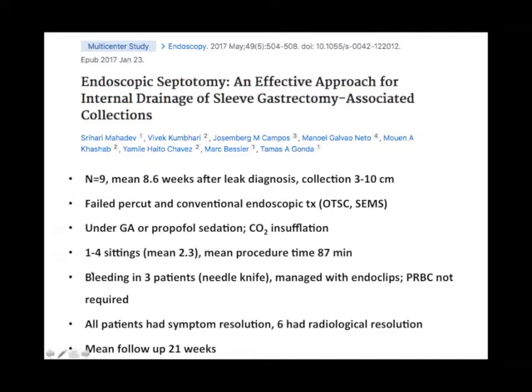So on an average, these patients had 2.3 sittings for septotomy, and the mean procedure time was roughly about 1.5 hours. 3 patients experienced bleeding, and in all these 3 patients, the incision was done using a needle knife. However, the bleeding could be managed with endoclips and no transfusion was required. All the patients had symptom resolution, but 3 patients did not have radiological resolution at the time of publishing this report, but they were asymptomatic. And the mean follow-up was around 20 weeks.